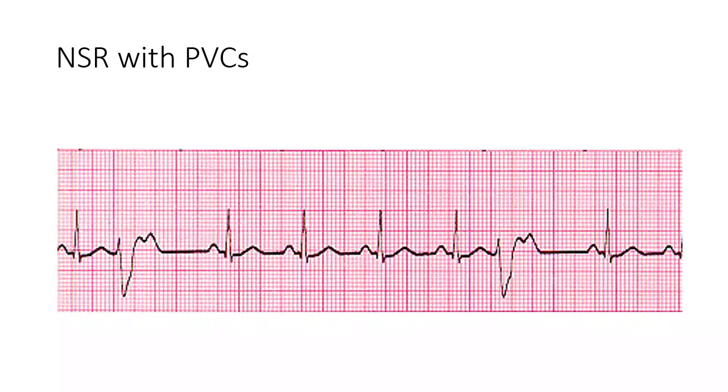Now, let's come back here and take just a minute. You called it a ventricular escape beat. Here's what you would see if it was a ventricular escape beat. You would see normal QRS, normal QRS, normal QRS, and then nothing, nothing, nothing, nothing. And then you would see that. It would not be early, it would be late. And then you could call that normal sinus rhythm or sinus bradycardia, whatever the underlying rhythm is, with an escape beat. Okay? Good. Bella?